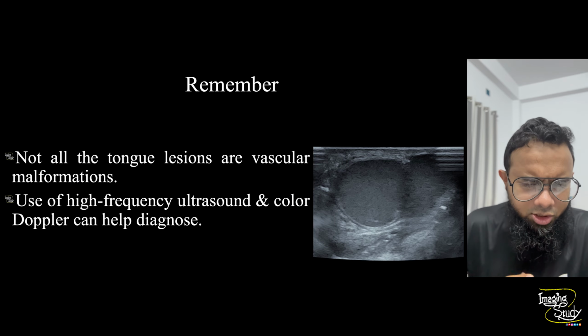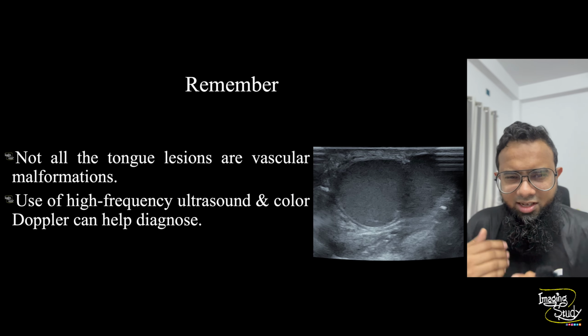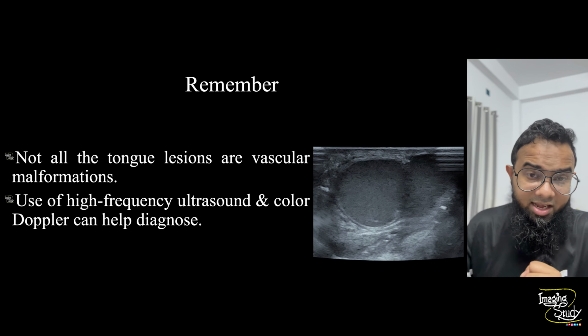Now the take-home message. Not all the tongue lesions are the vascular malformation, so just get rid of that concept. Use high-frequency ultrasound, use color Doppler, and then you can easily diagnose the lesion.